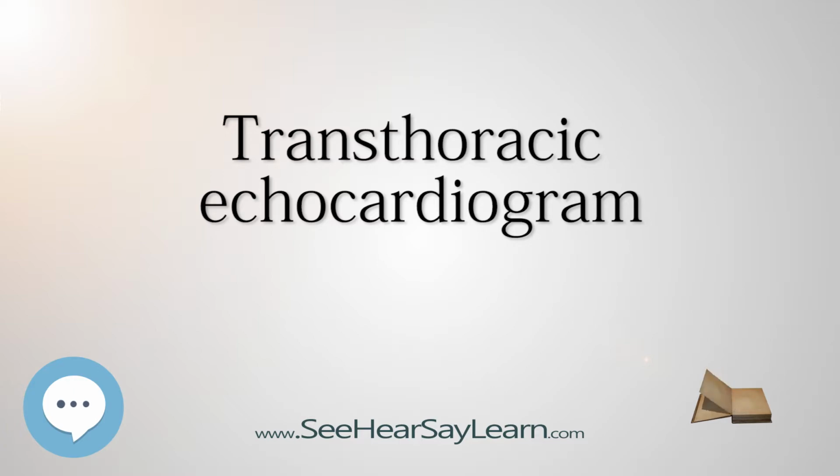Bubble contrast TTE involves the injection of agitated saline into a vein, followed by an echocardiographic study. The bubbles are initially detected in the right atrium and right ventricle. If bubbles appear in the left heart, this may indicate a shunt, such as a patent foramen ovale, atrial septal defect, ventricular septal defect or arteriovenous malformations in the lungs.